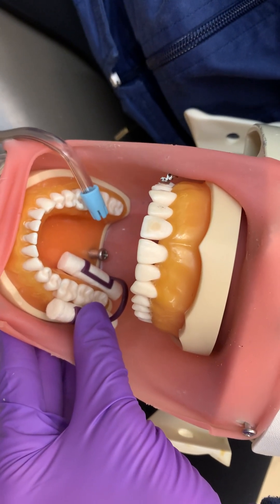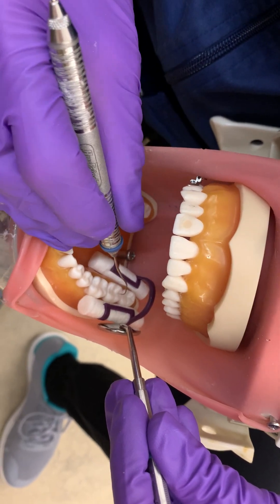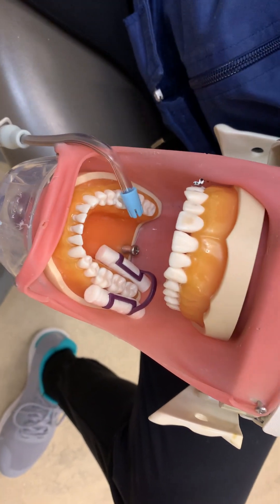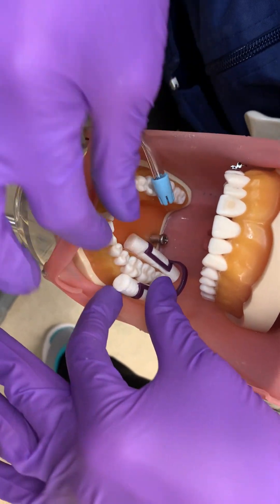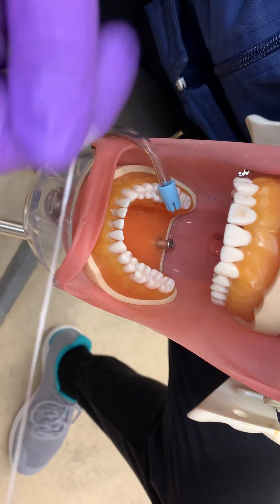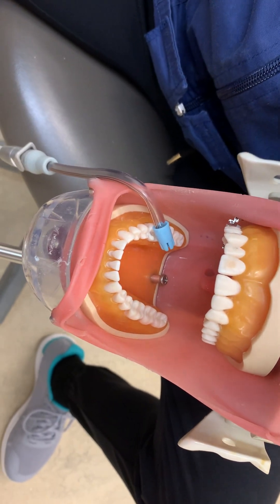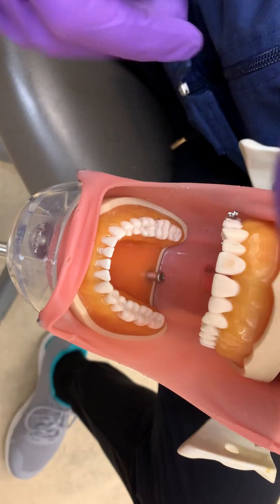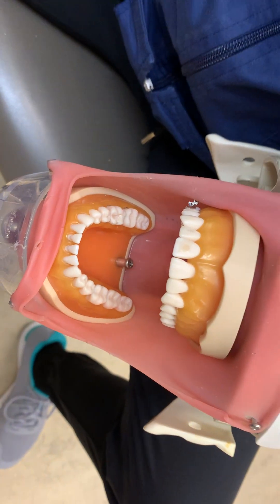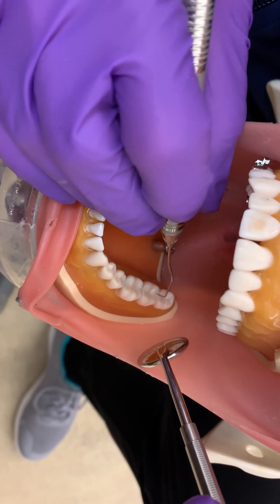She's going to inspect the sealant surfaces now with an explorer for any missed areas. If there are any missed areas, she is going to have to repeat the procedure starting at applying the sealant material. She's going to floss the proximal surfaces to make sure that none of that sealant material has flowed interproximally. She's going to check for occlusal smoothness and make sure there are no bubbles in the sealant material.